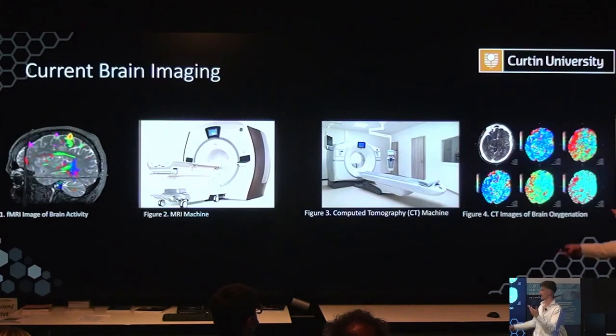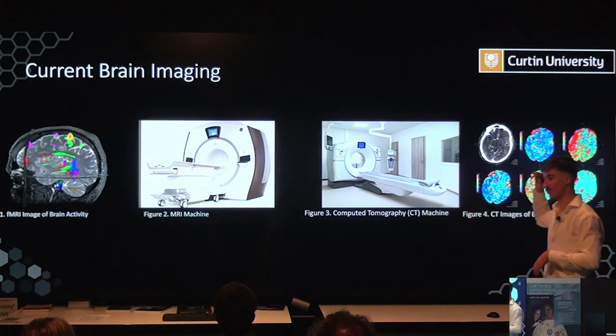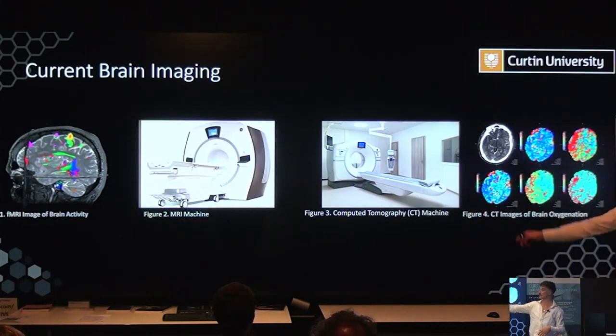You might be familiar with things like fMRI or CT scan. And if you're familiar with those, I'm sure you're probably familiar with potentially how complicated they are, not to mention expensive, or even that they might come along with some drawbacks, whether that's powerful magnets in the case of MRI or the large radiation dose that goes along with a CT scan.